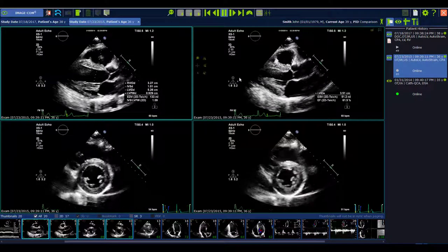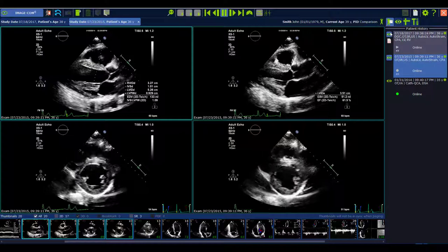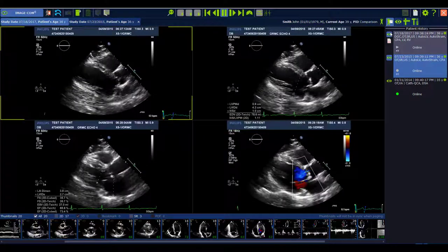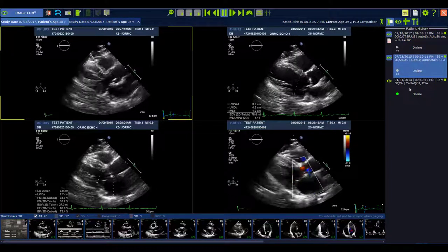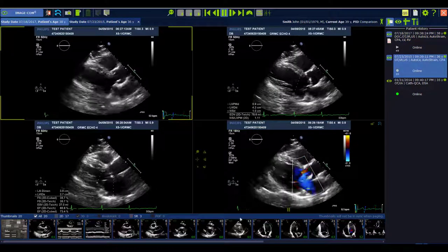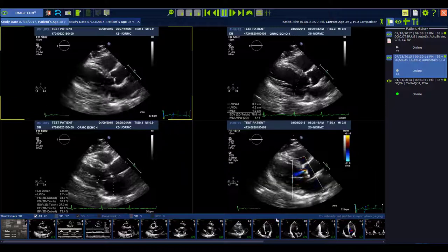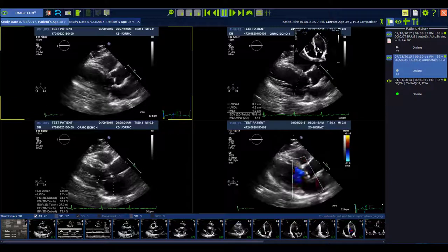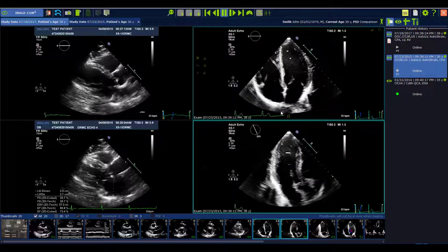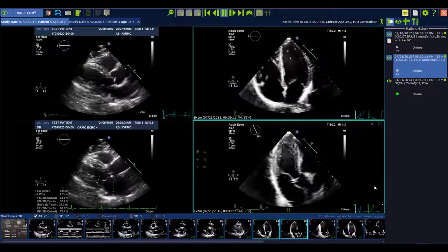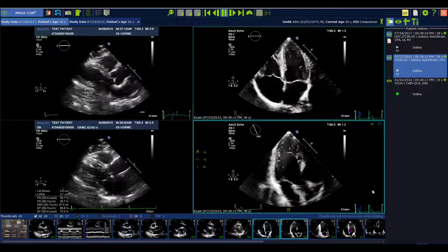You can also load the active study completely and have the old study only in the thumbnail bar. You see the blue background, and then you can drag and drop all the images in the viewing area like before in the older versions.